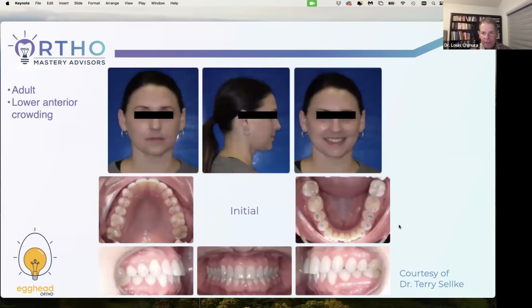This one would be borderline, okay? If you look at those lower anteriors, they are all crooked, and the lower right central is tipped out. You need to have space to bring them forward. You have small upper laterals. The midlines are on, everything else looks good. But if you look, the upper bicuspids are tipped in relative to the canines. And so are the second bis, and so are the molars.